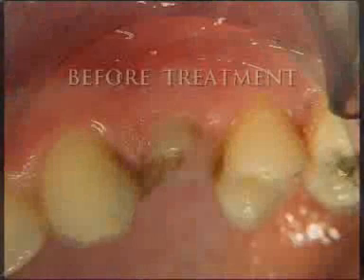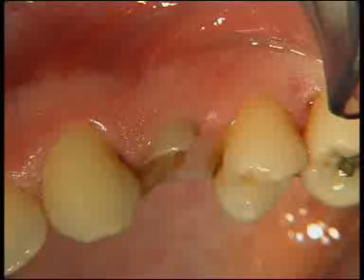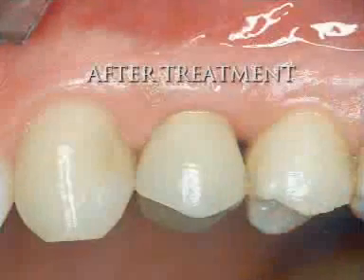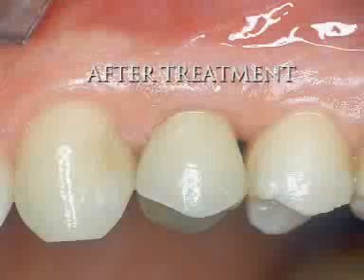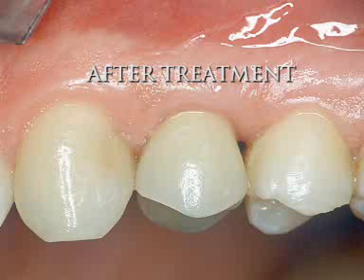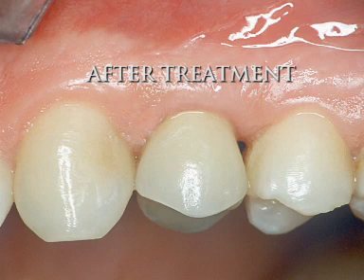After an adequate amount of time for the healing process to be completed — in this specific case after six months — the premolar was completed with a gold ceramic dental prosthesis, fully satisfying both the surgeon's and the patient's functional and aesthetical needs.